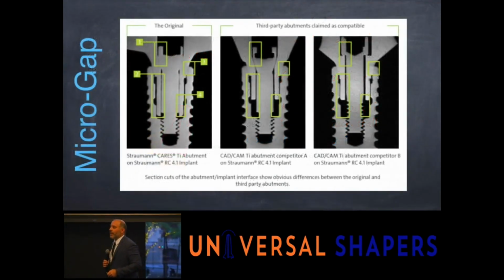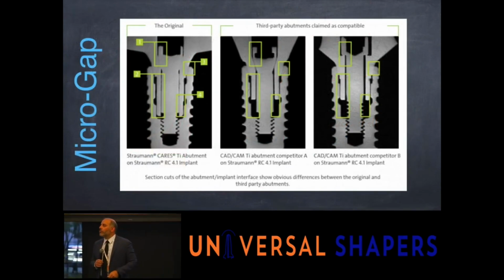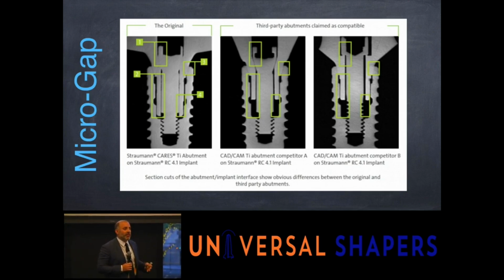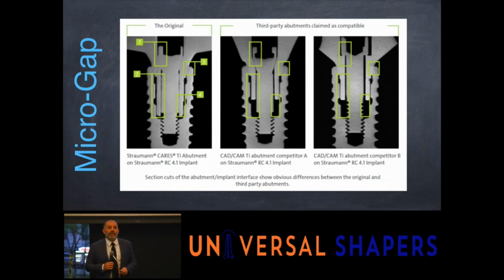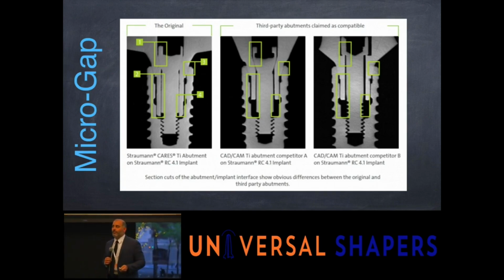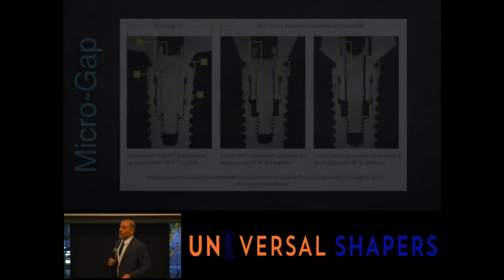Looking at an SEM microscope, this is a Straumann implant, comparing the different types of connections and looking at where that eliminates the microgap can certainly be very helpful in reducing the amount of bacteria that's going to stay in the area. Is it ever going to be zero? I'm not sure we could ever say it's going to be zero. But right now, with conically connected implants, it's at a level where we don't have to be as concerned about the microgap as we used to be. So something else is causing dieback.